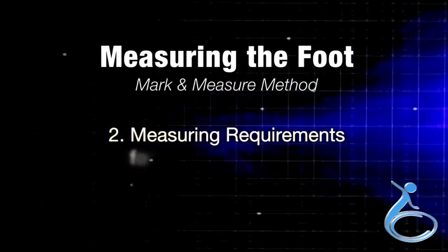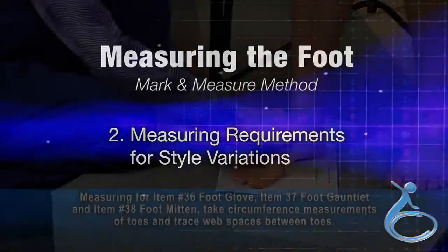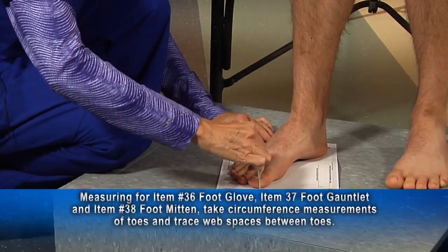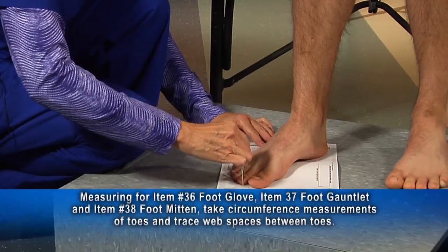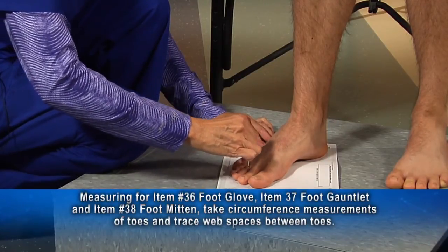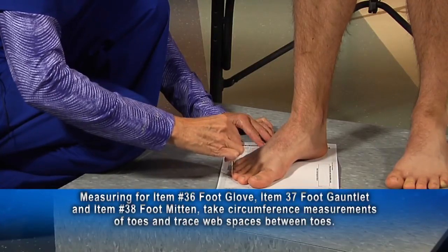Section 2 of the video covers measuring requirements for style variations. When measuring for a foot glove, foot gauntlet, or foot mitten — specialty items required for the separation of toes — a tracing of the foot and toe circumferences would be required. Use the foot tracing guide.